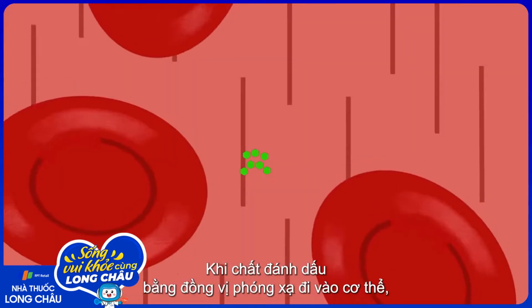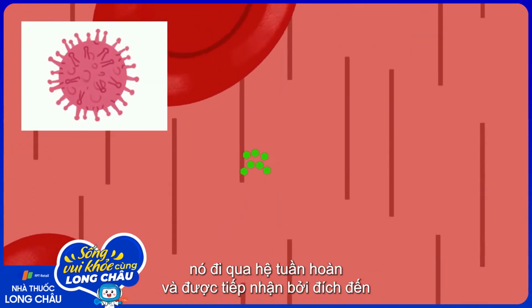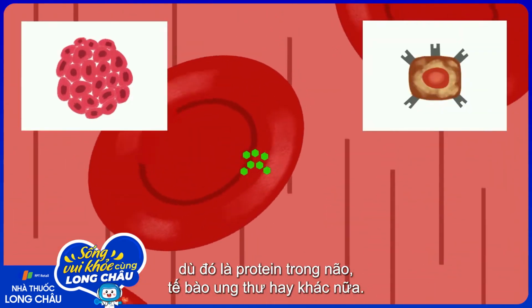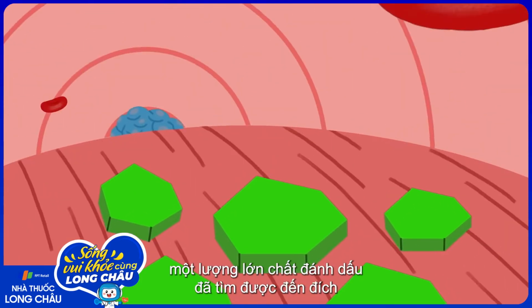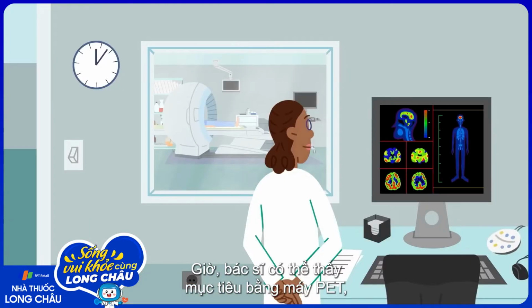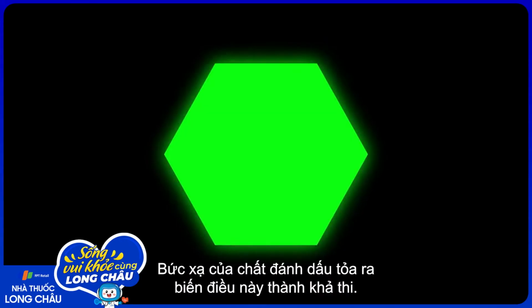When a radio-labeled tracer enters the body, it travels through the circulatory system and gets taken up by its target, whether that's a protein in the brain, cancer cells, or otherwise. Within a few minutes, a significant amount of the tracer has found its way to the target area, and the rest has cleared from circulation. Now the doctors can see their target using a PET, or positron emission tomography, scanner. The radiation that the tracer emits is what makes this possible.